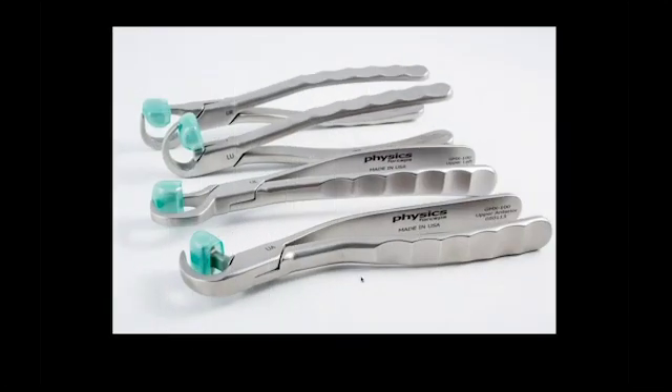So the physics forcep — Kurt can demonstrate this a little bit later — it's a series of four instruments: an upper right, upper anterior, upper left, and a lower universal instrument.